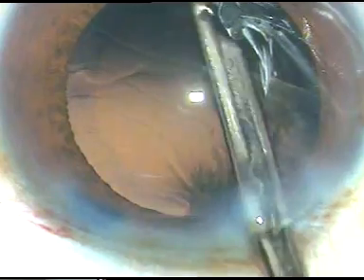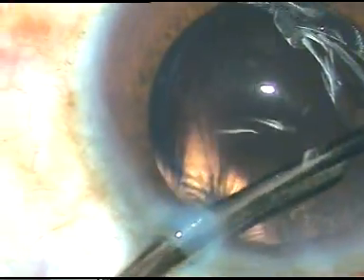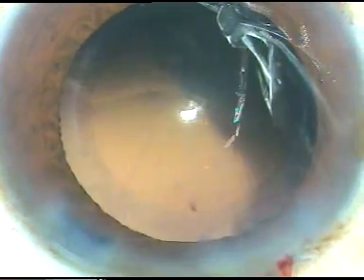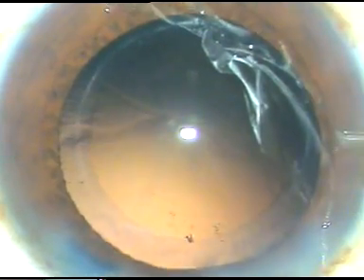The time to change the tubes. You have to remove the aspiration tube as well as the irrigation tube and attach the irrigation-aspiration probes, and this time is utilized. That is a lot of time. Once you don't wait, the rhythm of surgery continues. When you have a long list of surgery, you try to save time at every opportunity.